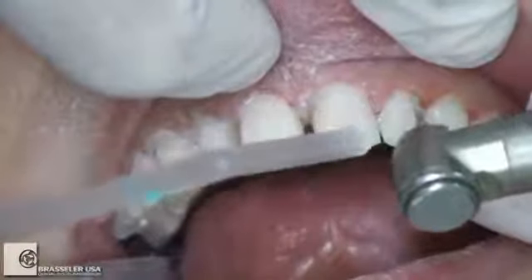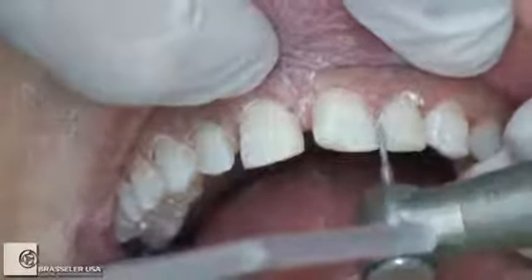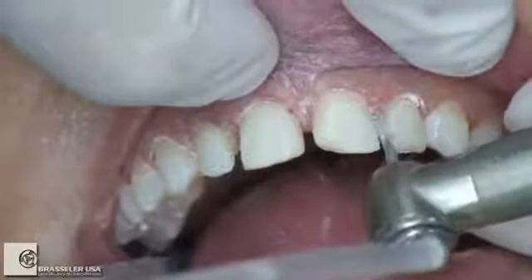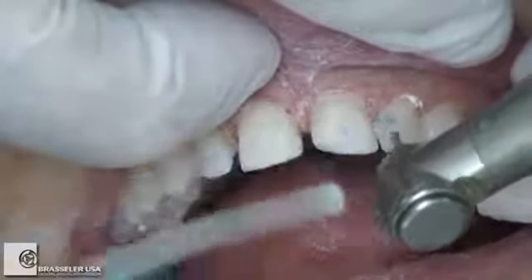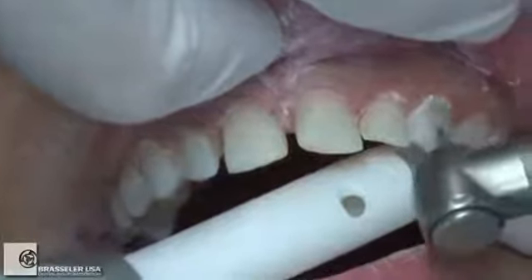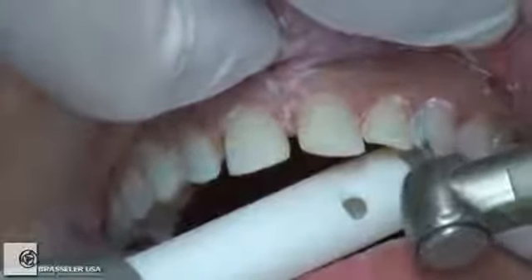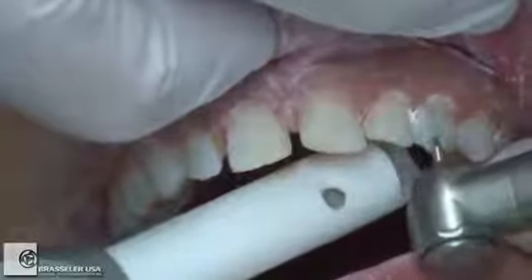And then we'll move over to the other lateral and do the same thing. And you can see that we don't have as big of space to close there, but I still move that finish line slightly to the palate. So we have a little running room to start that porcelain a little bit more lingually to be able to close off the space. Now we'll go ahead and finish the other canine, and just again put a light chamfer in there. We've got plenty of space.